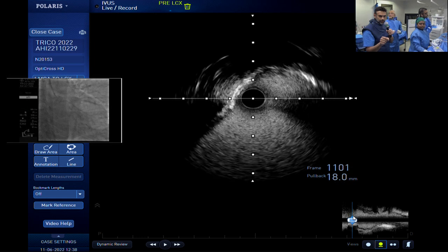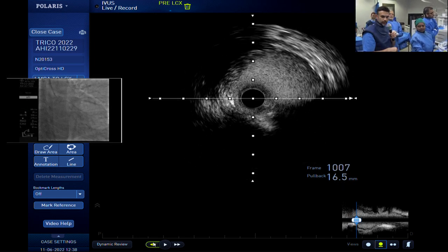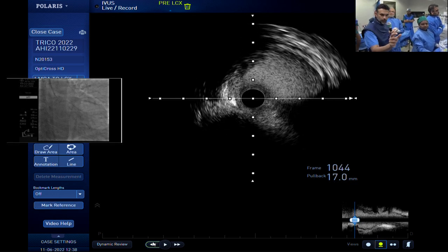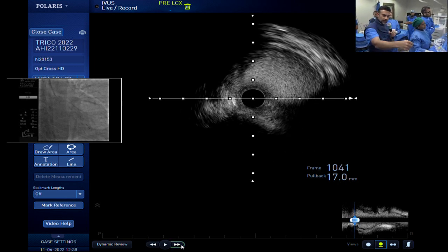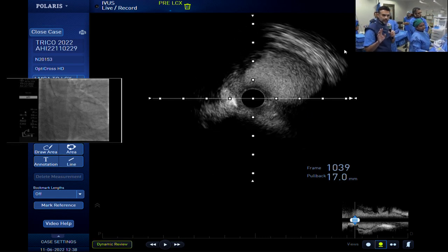Slowly, slowly come back. Okay, so that's it. Come back a little bit more. That's about your tightest point, right? You can come back here and there a little bit. Just as the ostium opens up is, I think, where your tightest point was. No, you've got a little bit of dropout, so I would come either in one frame or out one frame. There. Measure that. So I don't use trace assist because I don't think it does a particularly good job.